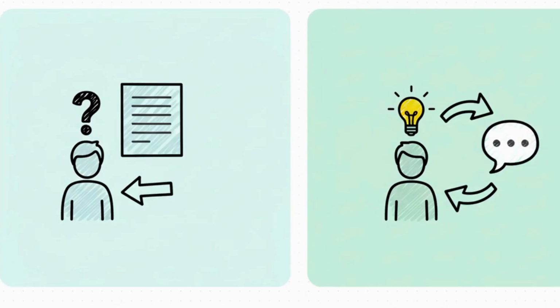And this comparison just lays it out perfectly. The old way? It's a one-way street. You get a text report, and good luck trying to figure out what it means. But the new way with KneeResolve, it's a real-time interactive dialogue. It swaps out all that confusing medical jargon for clear explanations, and it even offers words of comfort. It empowers patients to ask questions and really understand what's going on in their own bodies.